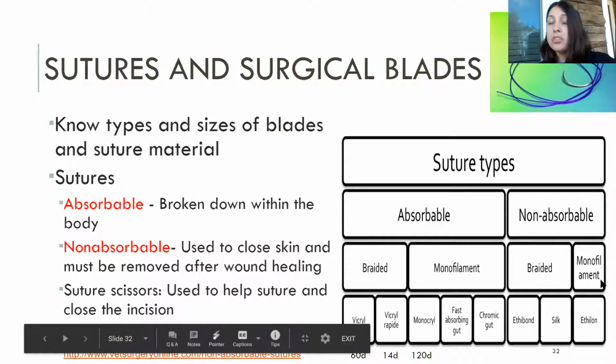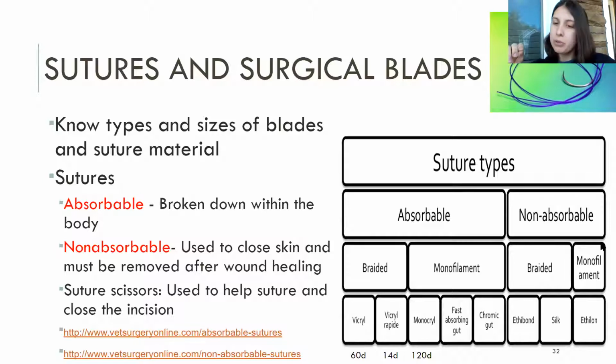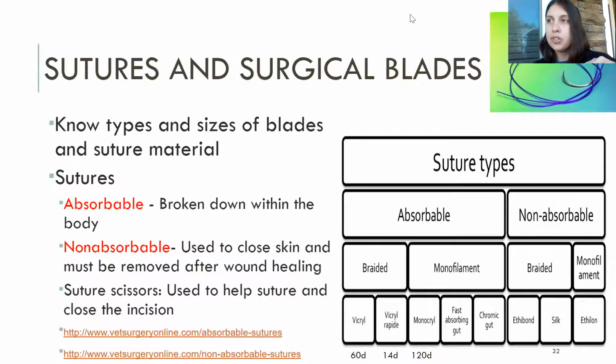These can take anywhere from 1 to 2 years, and they can just sit in the body. The silk suture type, the body will slowly absorb if need be, but that's going to be like 2 years of you with sutures. Primarily, the reason you're going to pick is where the suture is going to have to be and how much pressure it's going to have to withstand. I put these 2 links in here, and they go through the different types of sutures, the pros, the cons, their shelf life, if that's what we want to call it.